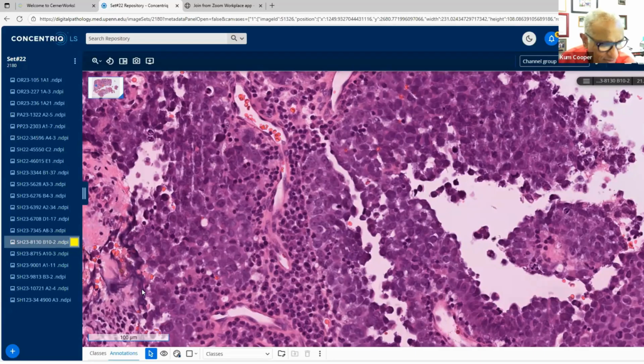Before I give you the result, I have another differential, esthesioneuroblastoma. Okay, those are olfactory neuroblastomas, and it's a good site because of skull-based tumors. And you'd want to do your neuroendocrine markers, and we've talked about this before, but I typically do all three neuroendocrine markers that we have, which is synaptophysin, chromogranin, and INSM1. So those are good markers.